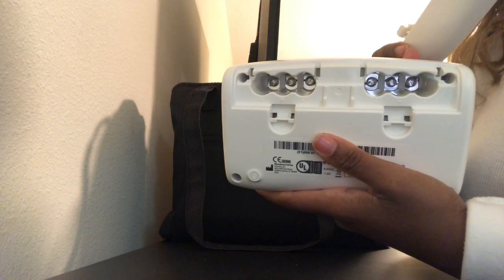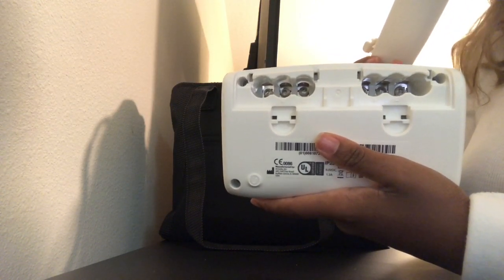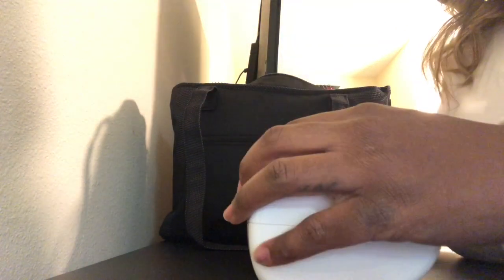You're gonna need 6 of these. Probably a really good brand, like maybe Energizer or Duracell or something like that, you probably might need.